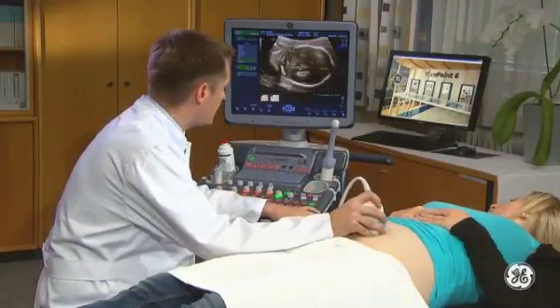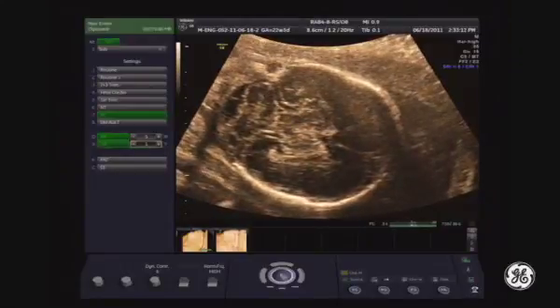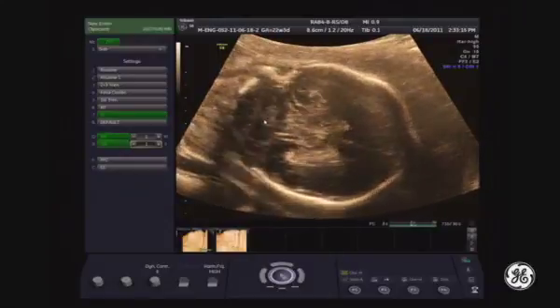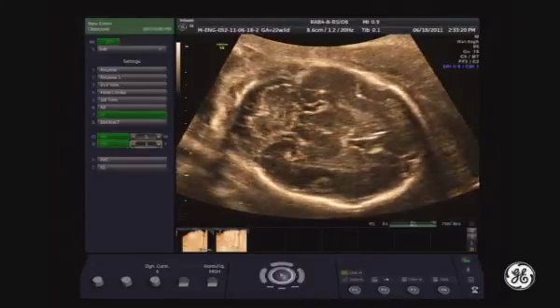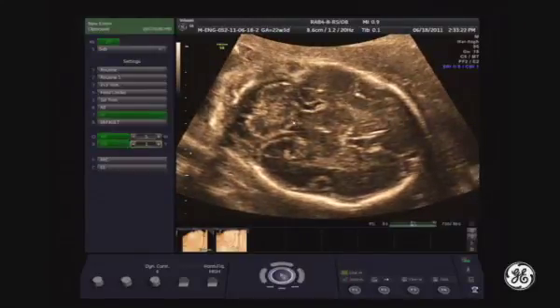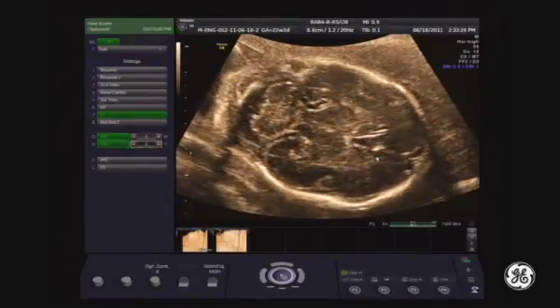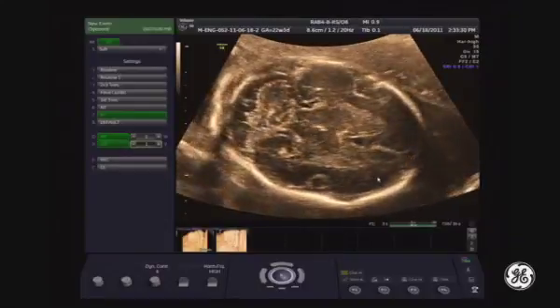This is why it is more recommended to have the access through the lateral fontanelle. Then you need to bring your TCD view slightly oblique. Then you can see the cerebellum nicely together with anterior aspects, so cavum septi and anterior horns.